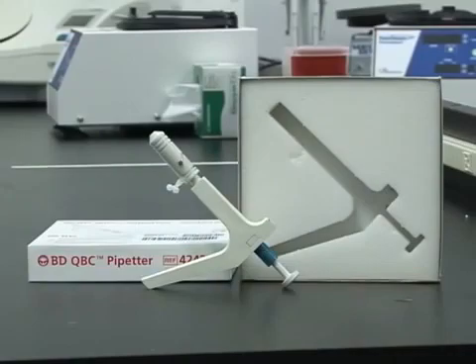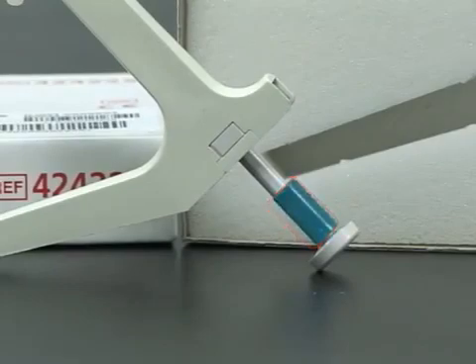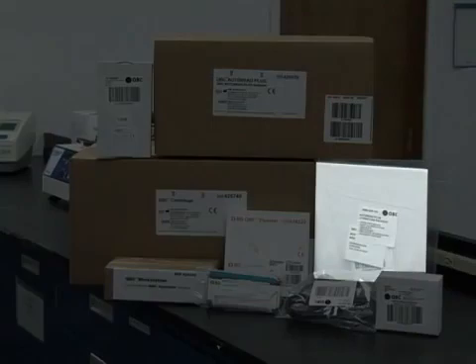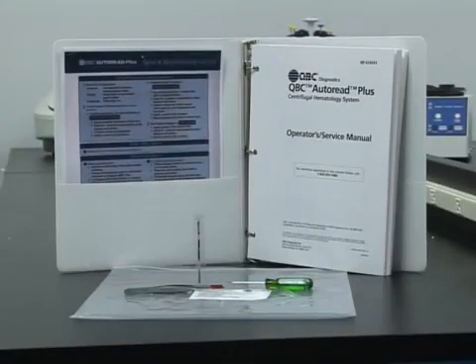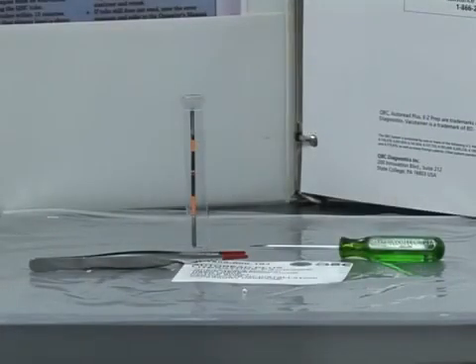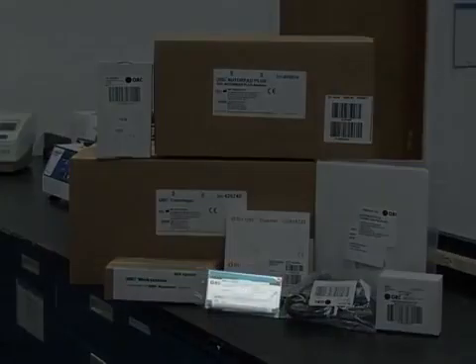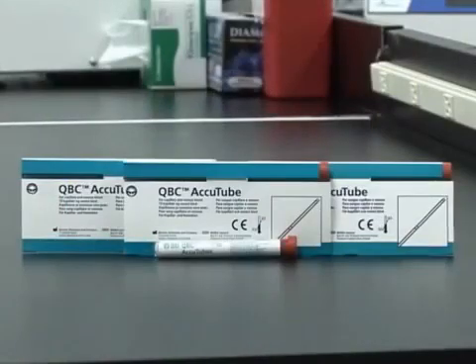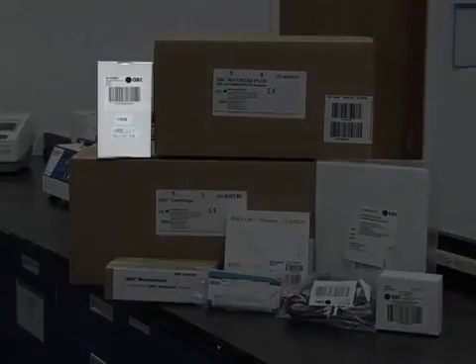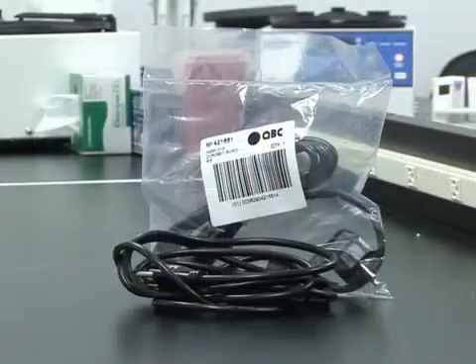Please note the proper placement of the spacer on the pipetter. Also included are the paperwork and accessories, AccuTubes, power pack, and power cords.